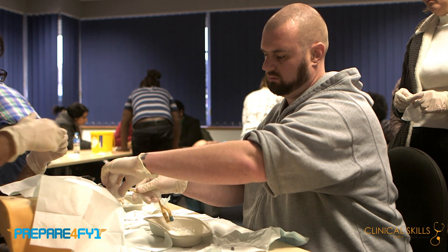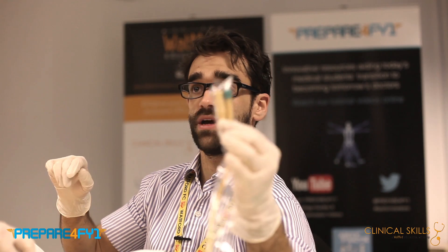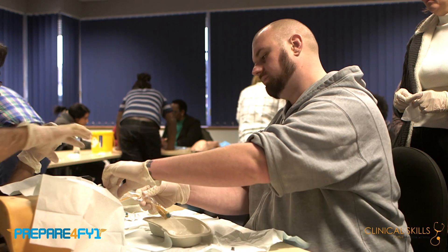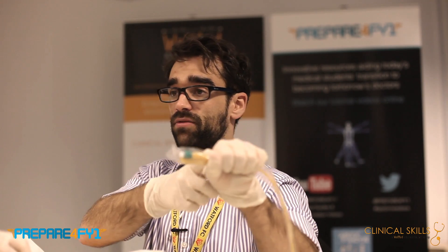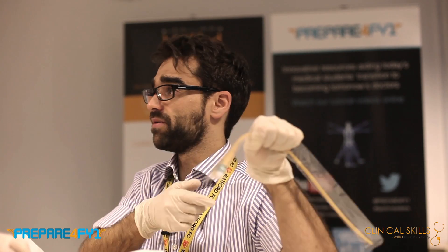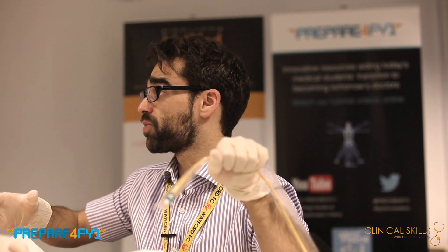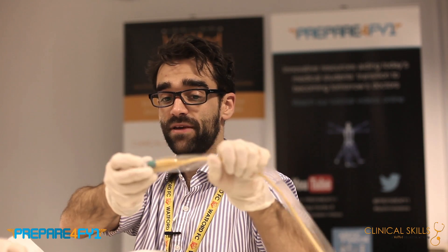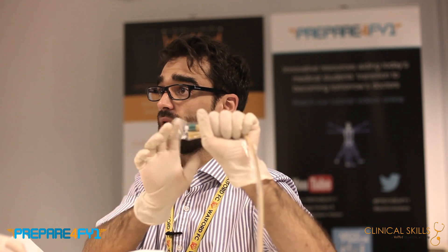Bear in mind on this model it won't go in all the way. In real life, it's better to advance it until the bifurcation goes all the way in. The reason that's important is because if the bifurcation is flush with the urethral opening, you will notice if it moves. If it moves a little bit, it could be in the urethra or the prostate and cause problems. If it's hanging out too far, it's harder to appreciate movement, but if it's all the way in, you know.